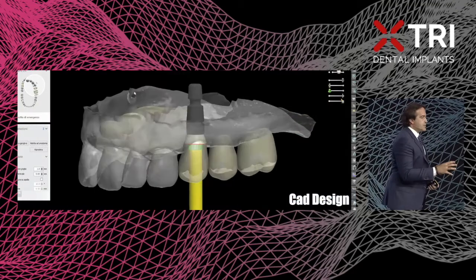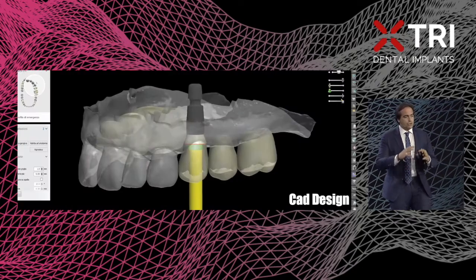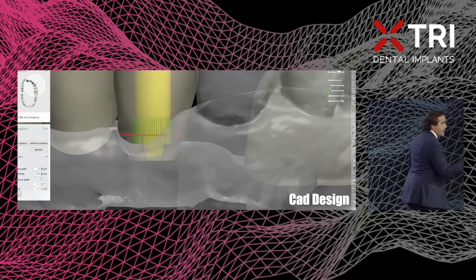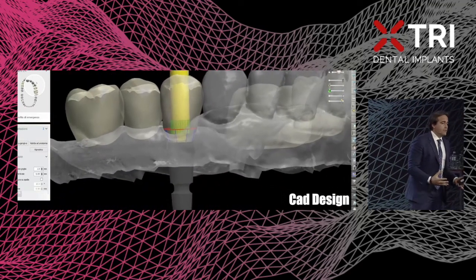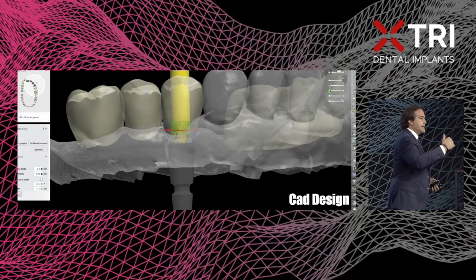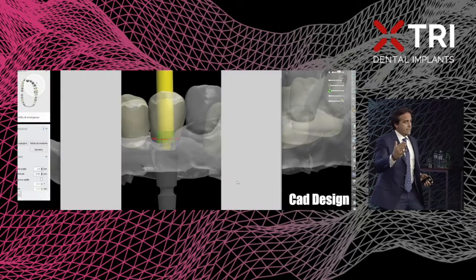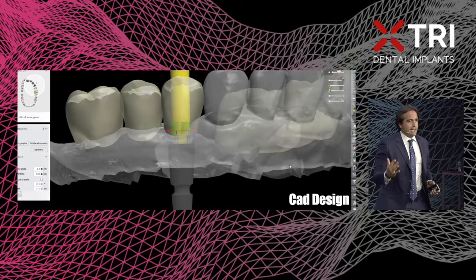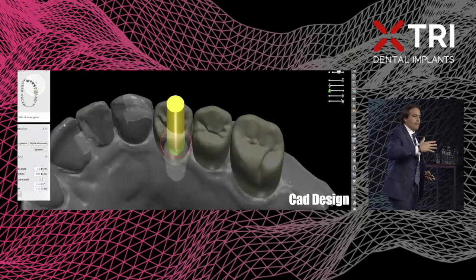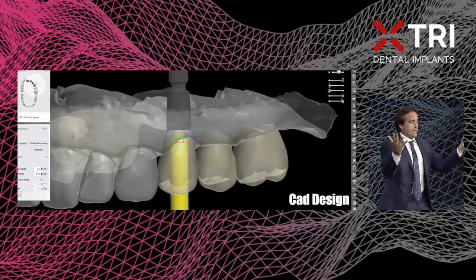And at the lab, you see the CAD design, once again done by Pierfrancesco Golfarelli, who is going to work on the emergence profile and on the thickness, and you see the great benefits that digital brought to dentistry: the control of the major variables that we have when we are facing these kinds of cases. And this is important because we are standardizing the level. Digital dentistry really standardized the level. And this is what technology is all about. We want to standardize the level of everyone, so we bring the average quality of our restorations to the height.